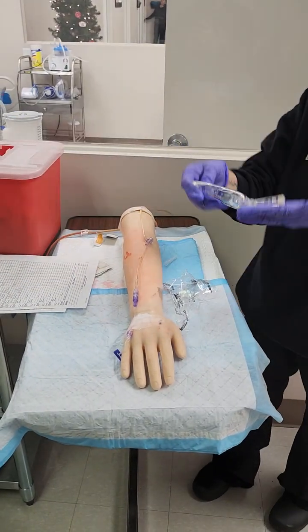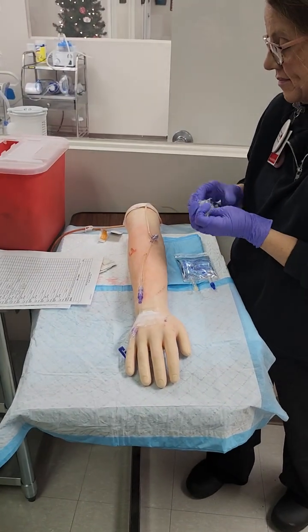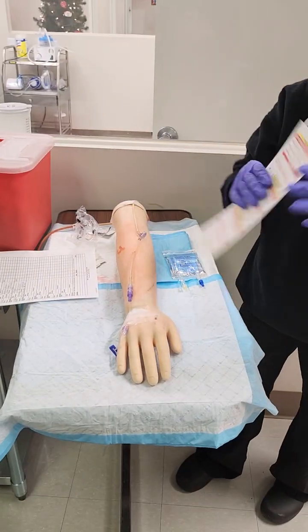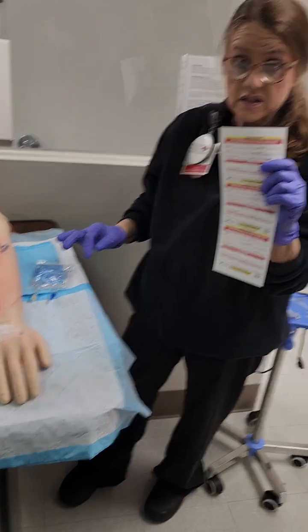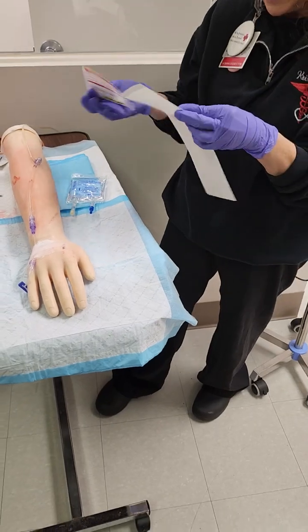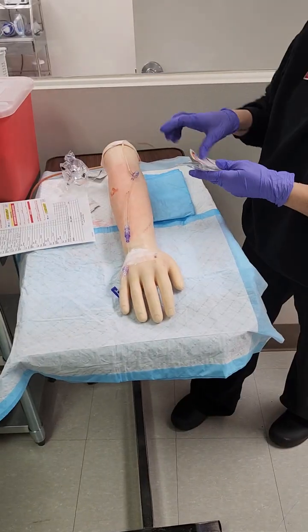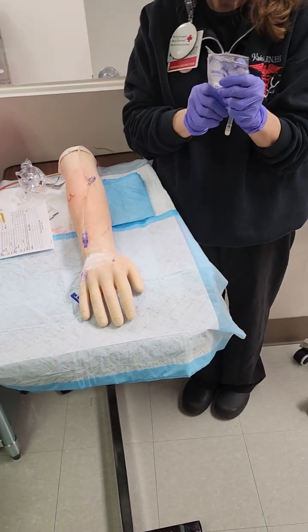Okay, just kind of gently agitate it. Anytime I add medicine to an existing solution or I have an IV solution, it always has to be labeled. I'm going to fill out my label with my patient information. I'm going to put on here what drugs I added to my saline, which was the Kefsol. Put that on. Now I have to determine my flow rate. Got to calculate my flow rate.